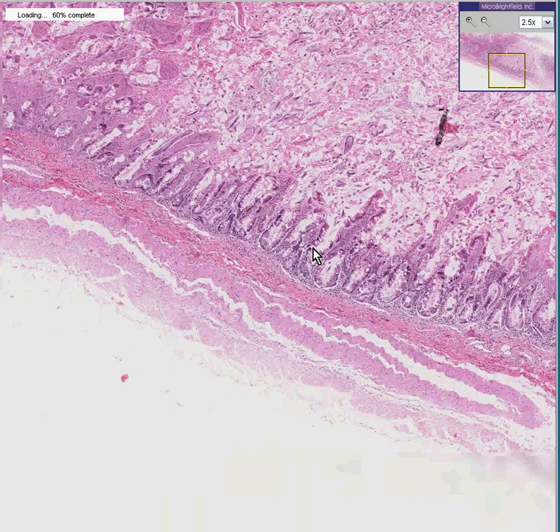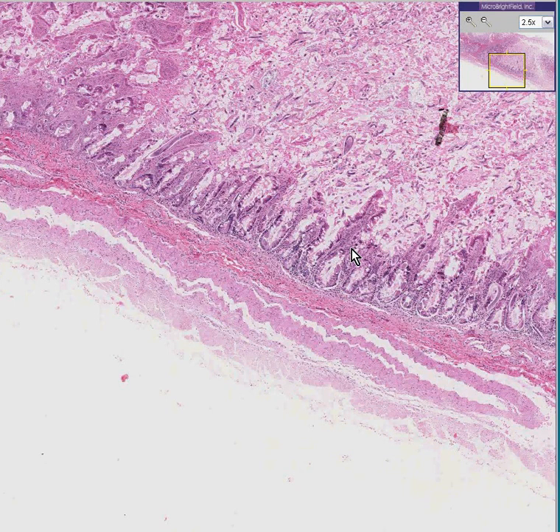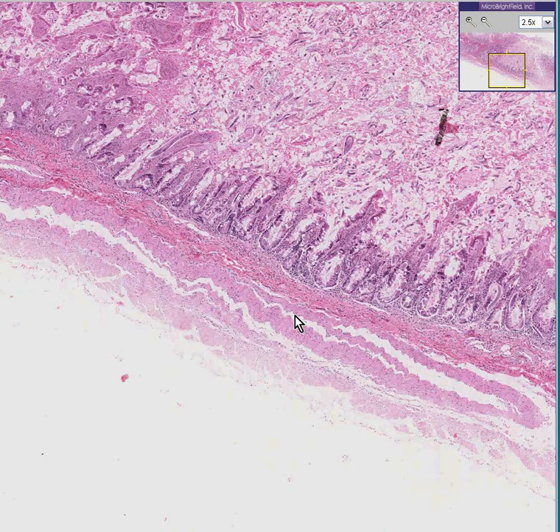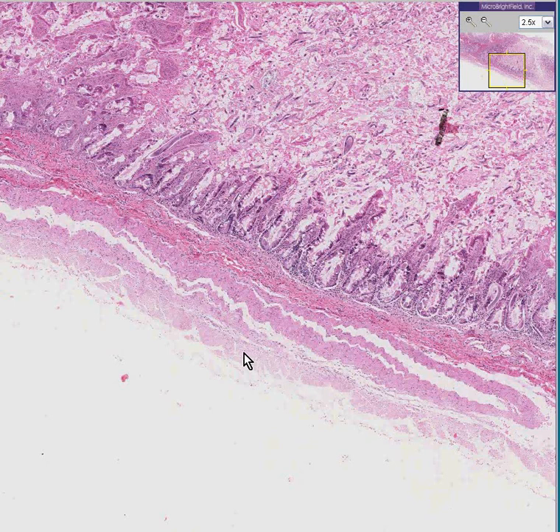Not only a mucosa but a villus pattern — these are villi, so that makes this small bowel. You could see muscle underneath, you could see connective tissue. Here's the submucosa and here's some smooth muscle, which has some artifactual cracks in it, often due to tissue processing. This could be circular and that could be longitudinal, but depending on how it's cut, we've been fooled before.